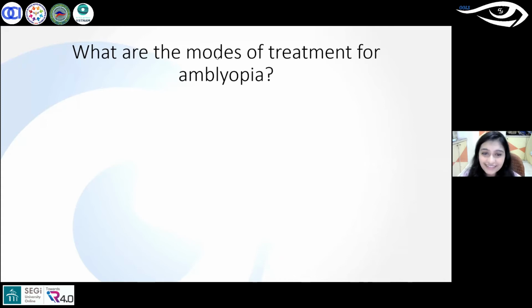That's very well done. Vision therapy exercises or vision therapy. Okay, great. So people are doing patching, people are doing vision therapy exercises. Some people also do atropine treatment, and somebody said they use direct or indirect patching. They also do exercises with the synoptophore as well as computer based therapy. So it's a wide variety of practice people are doing here.